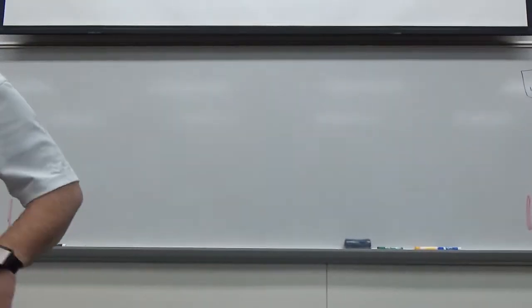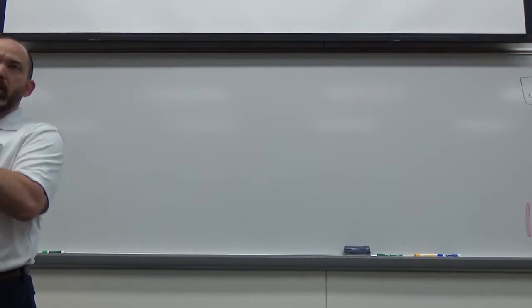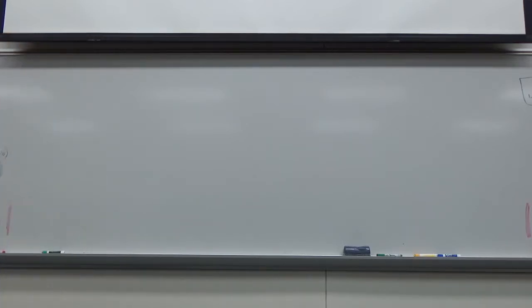Yeah, with and without Valsalva. So the first one on the top of the chart. Now, my recommendation is for your, what did I call it? Your study guide thing that you do. Portfolio. Thank you. So for your portfolio, what I recommend doing is going through and drawing yourself a full diastolic chart diagram. That way you're kind of sinking in: okay, I need to get mitral inflow, and then what do I see in each of those stages? Do it with Valsalva. You need your tissue Doppler, you need your pulmonary veins, and you need your propagation velocity.